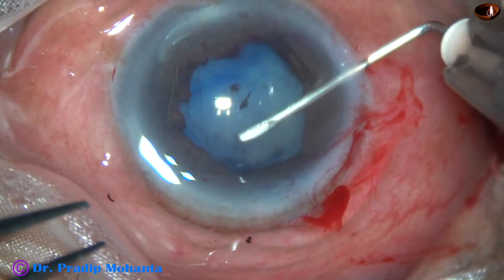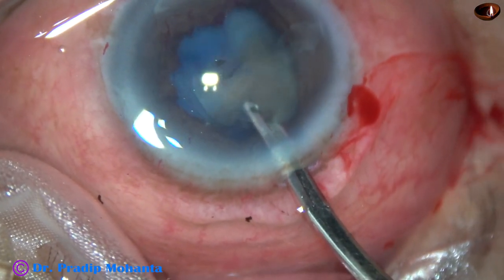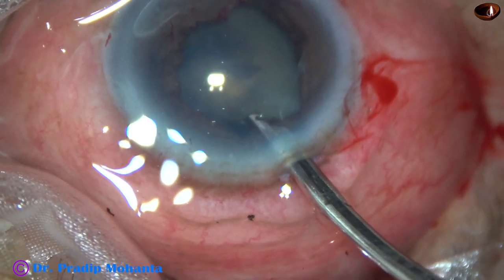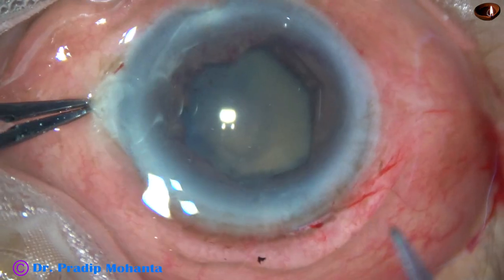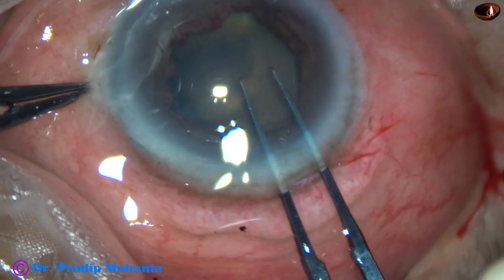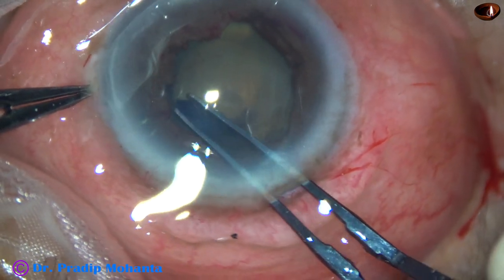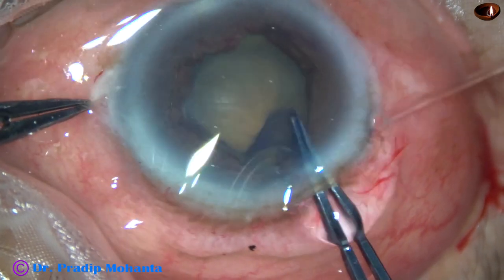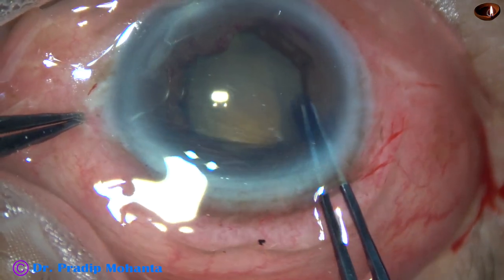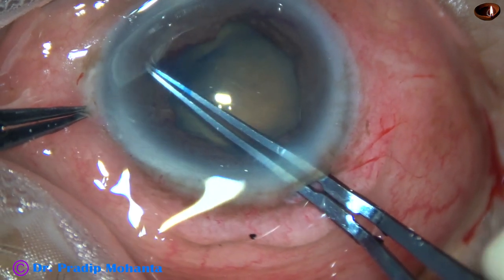The anterior capsule is incised with a 26-gauge bent needle and milky fluid comes out. I take a 23G Simcoe cannula to wash the milky fluid, then fill the anterior chamber with viscoelastic. I use Utrata forceps to perform an optimum-sized capsulorhexis. Very carefully the rhexis is done — I cannot hurry at this stage.